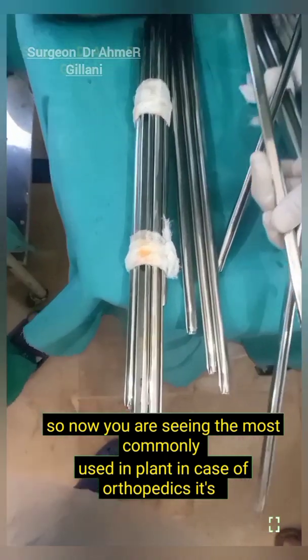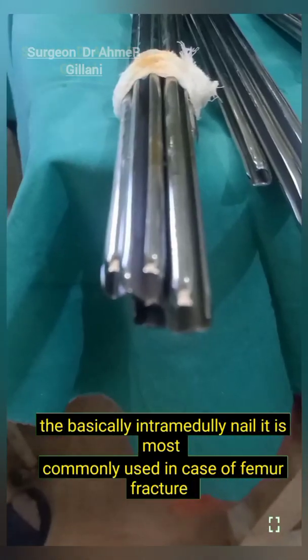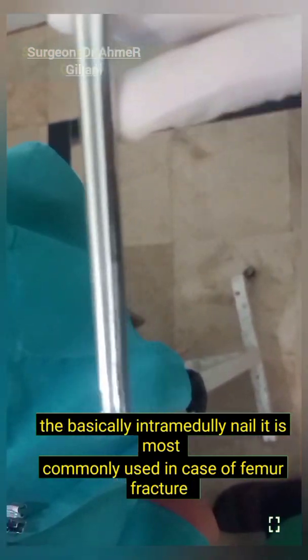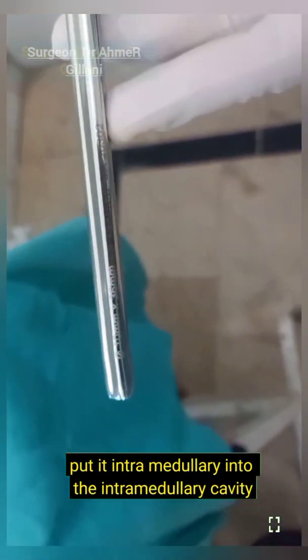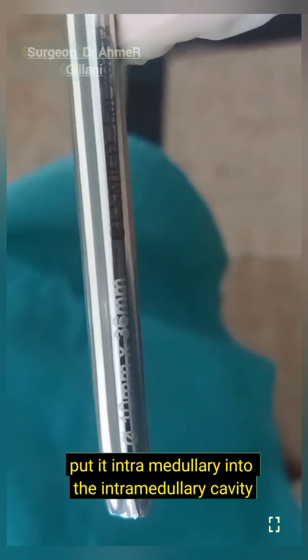Now you are seeing the most commonly used implant in orthopedics. It is basically the intramedullary nail. It is most commonly used in case of femur fracture and is placed into the intramedullary cavity.